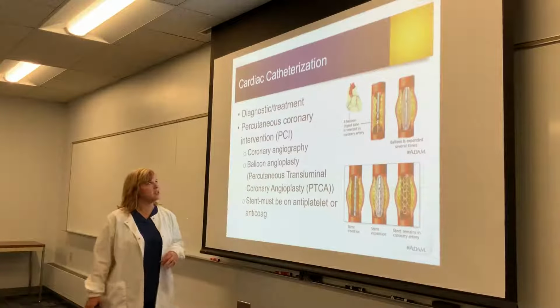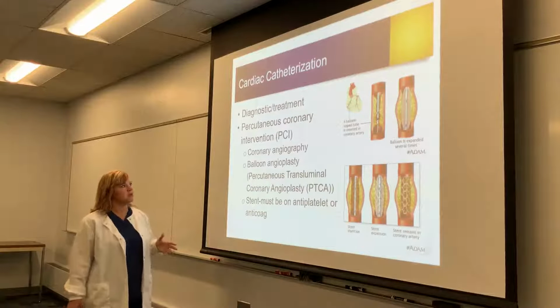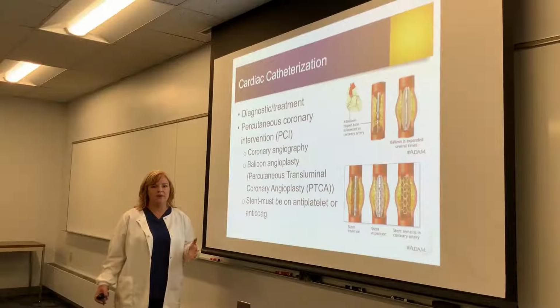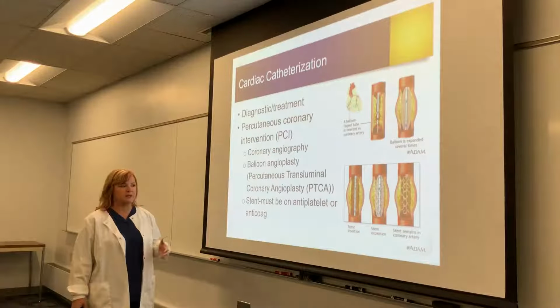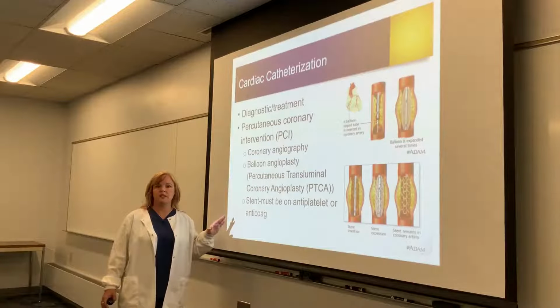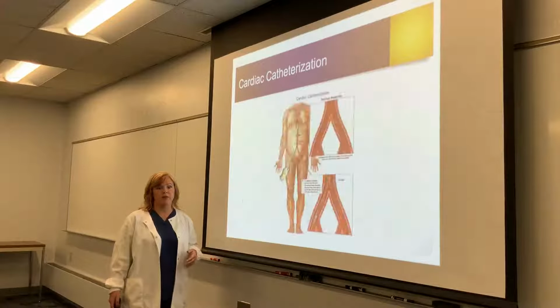So cardiac catheterization can be both diagnostic and treatment. It has a lot of different names out there, and we have some of those listed here. It does depend on whether they've done an intervention or not, if they've done angioplasty, which is the ballooning, if they've left a stent. So you might see different names, but basically we're talking about the same procedure. I do want to mention that if they do have a stent put in, they will be on anticoagulant or antiplatelet medication for life while they have a stent in.